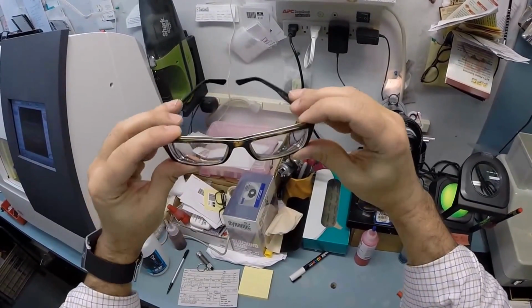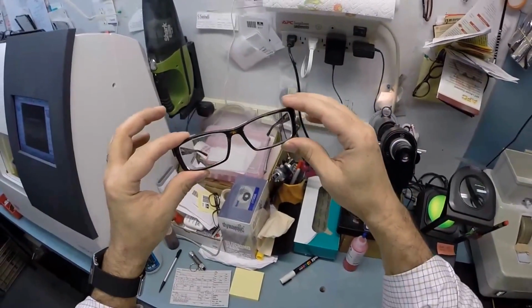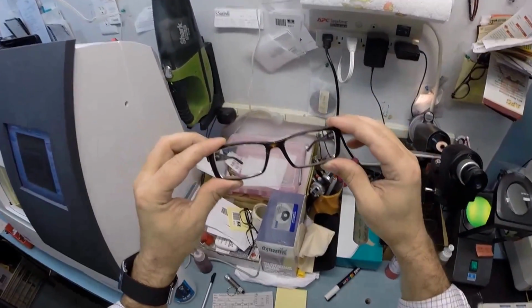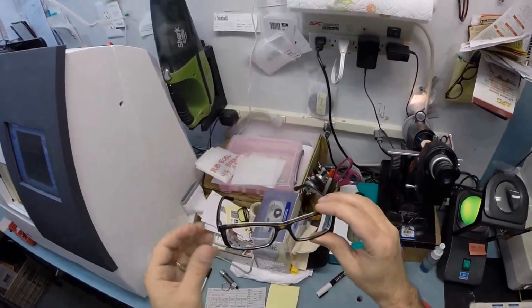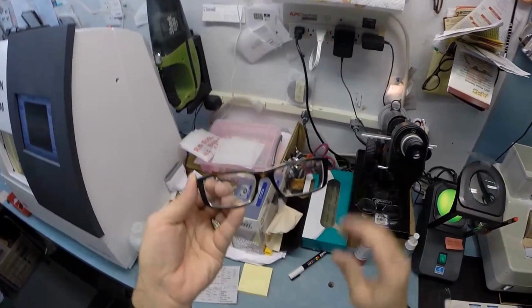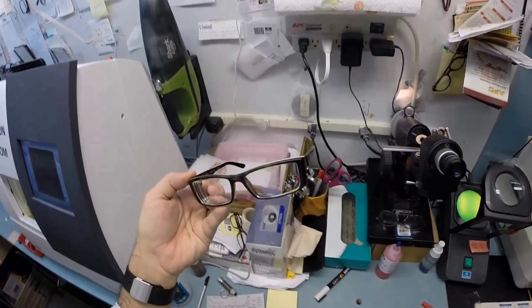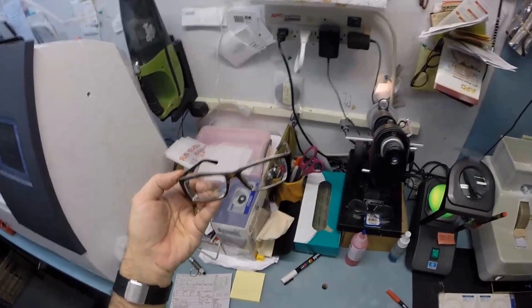Okay, so when you get these in the mail, there's a small chance that these will be too loose or too tight. However, there's an 80% chance that one side is going to sit higher than the other. That is because 80% of people have one ear that is higher than the other. And because of that, 99% of all the optical shops in America will do free adjustments. I'm not sure what it's like in Mexico, but we'll need to look into that.